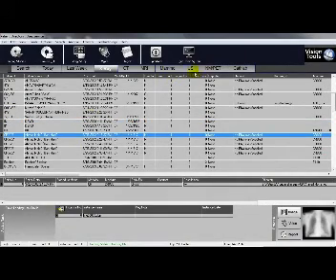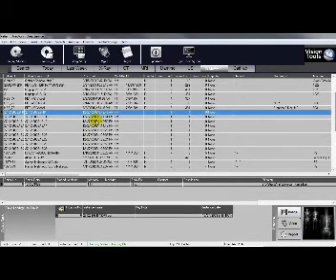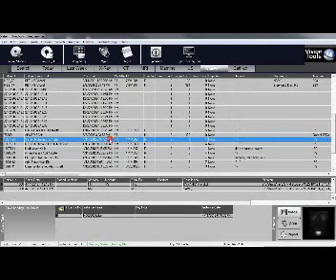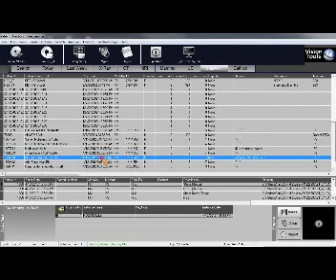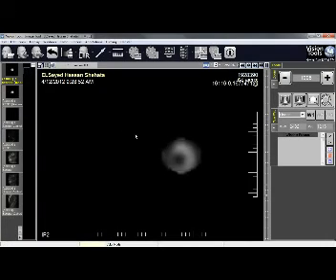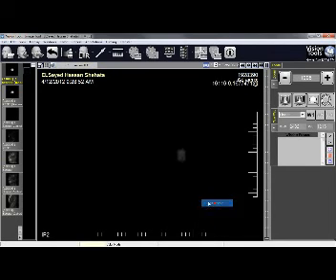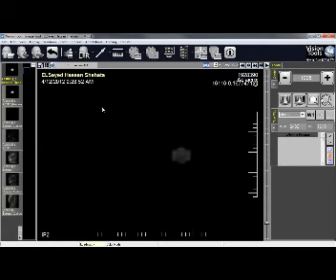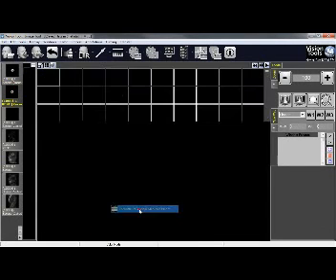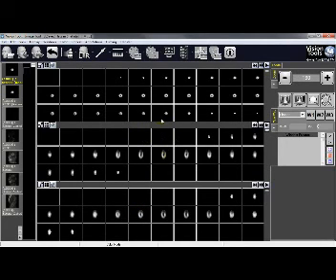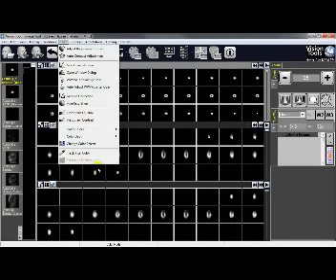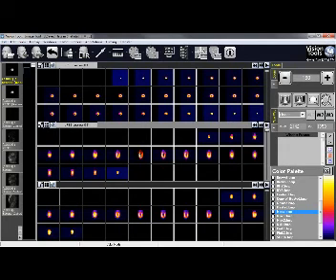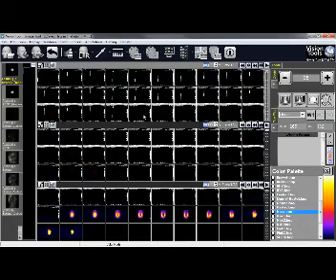There are also new features for nuclear medicine and PET/CT studies. For example, selecting a stress study, you can select frames and reconstruct the nuclear medicine series. Changing the color palette — for example to the Metal palette — displays the nuclear medicine study with the appropriate color scheme. This is a new feature in this version.